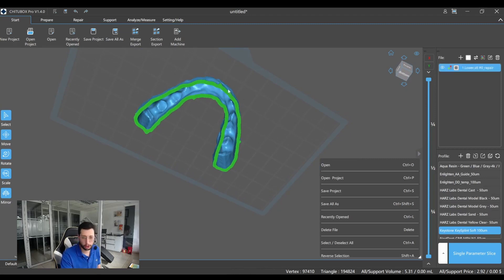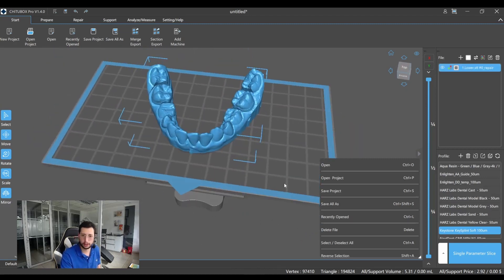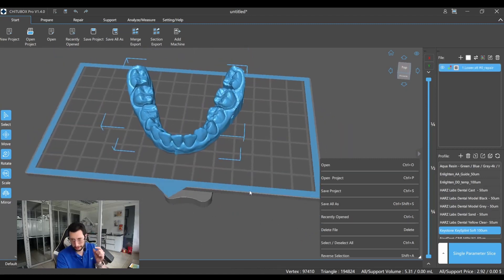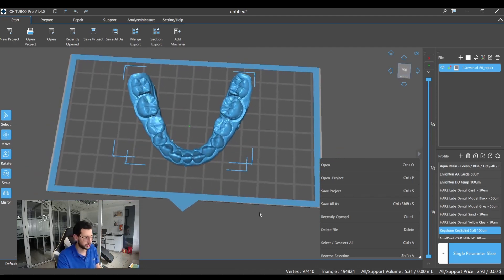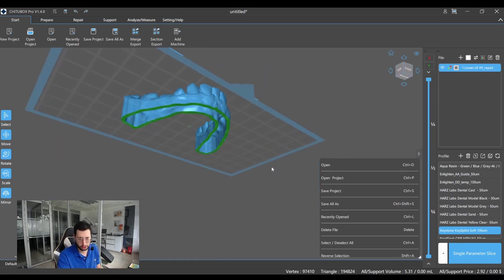Now as you can see, this is a hollow model. I do recommend printing hollow models with enough thickness — it will consume less resin, and there is basically no reason to print solid models.